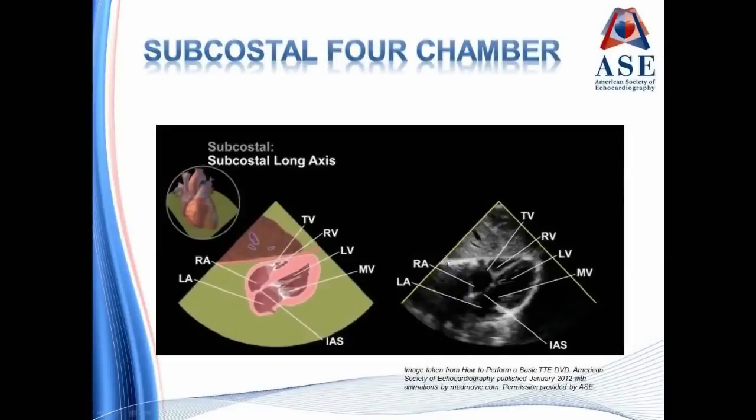From the subcostal long axis view, the tip of the triangle is at the transducer, which is on the abdominal wall. So the first structure you see here is the liver. We then see the diaphragm, the right ventricle, the left ventricle, and the atria.